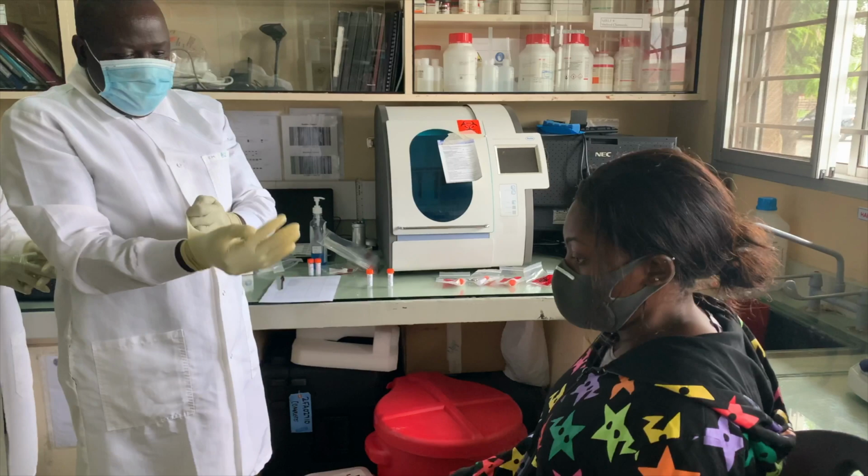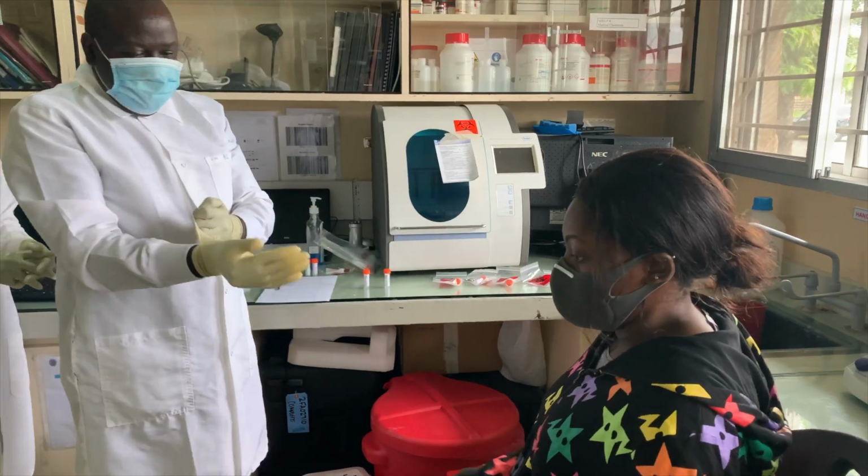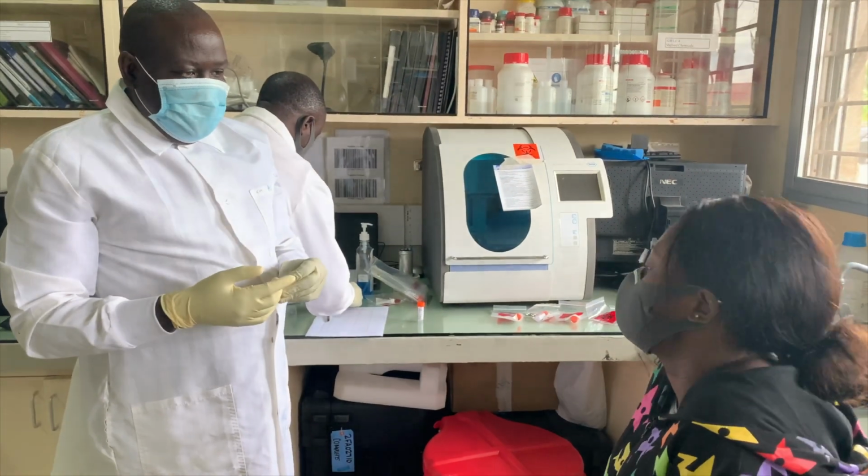Testing for COVID, how does it start? So first of all, a lab technician has to collect a sample from the person who has exhibited these symptoms, or if you just want to know your status.